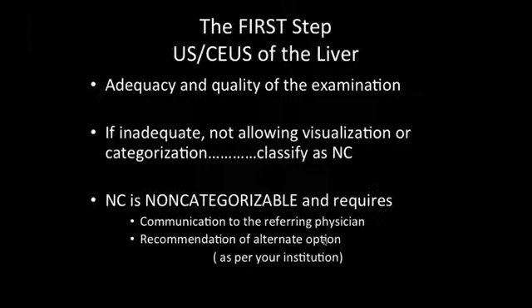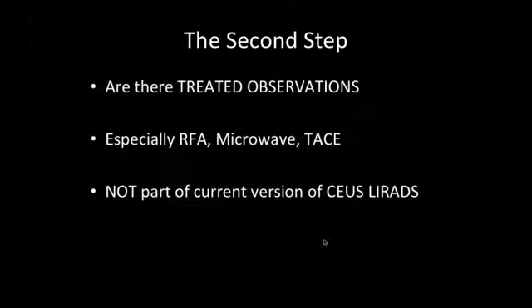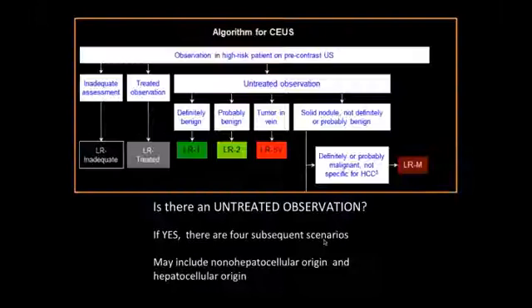But all of these require classic enhancement on CEUS. So they have to have both baseline and CEUS observations in agreement. The value of CEUS for LIRADS 1 is that benign nodules are a regular occurrence in both a cirrhotic and the at-risk liver, and we include all types of hemangiomas, including those that are flash filling. The dynamic real-time capability of CEUS is superior to all other modalities to show the rapidly changing enhancement patterns of particularly flash-filling hemangiomas.